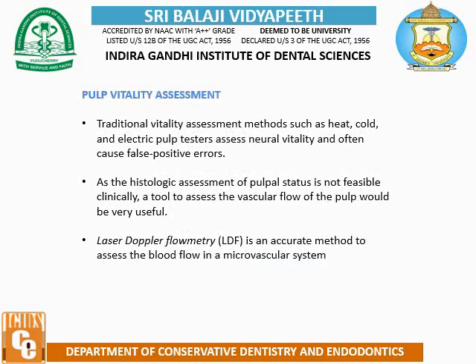Pulp vitality assessment. Traditional vitality assessment methods such as heat, cold, and electric pulp tester assess neural vitality and often cause false positive errors. As the histologic assessment of the pulp status is not feasible clinically, a tool to assess vascular flow of the pulp would be very useful.